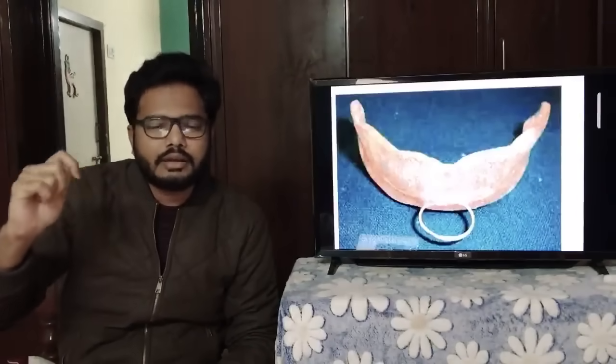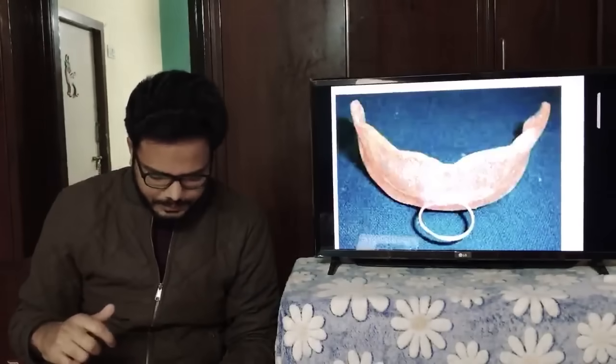Yes, Sanju, well said. So this is vestibular screen, also called oral screen. It's used for intercepting various habits, mouth breathing habit, or it can be thumb sucking, lip biting, cheek biting. Also, it can help in harnessing forces from circumoral muscles and directing those minor forces onto teeth, or it can be used for eliminating those circumoral muscle forces on teeth. It can be used two ways, right? The ring which you see enables the patient to remove and place it for holding the appliance, right? So it's an oral screen or vestibular screen for mouth breathing habit.